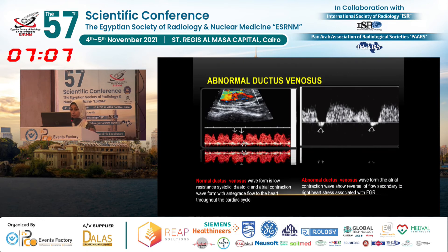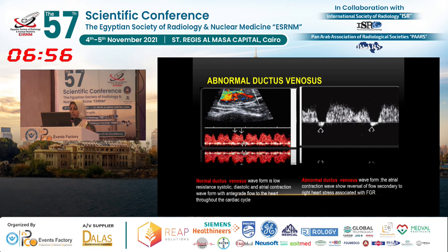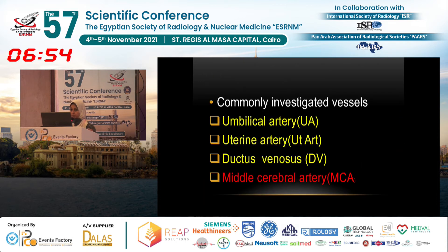What is the abnormal ductus venosus finding? The abnormality is reversal of the A-wave. This indicates the presence of right heart stress leading to reversal of the A-wave, as seen in this case.